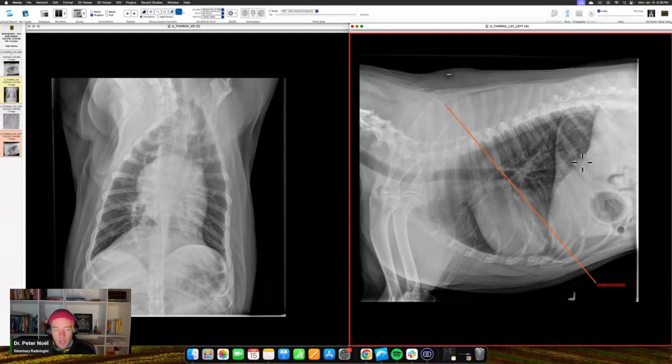Caudal dorsal, it's cardiogenic or non-cardiogenic pulmonary edema, and just plain probability, you're most likely dealing with the cardiogenic. Okay, so this is a cranial and ventral distributed alveolar pattern. The way you would describe this, I like to start with the anatomy, because if you read the report, the anatomy takes you right away. You say in the right middle lung lobe, there's increased soft tissue opacity that completely obscures pulmonary blood vessels and yields discrete air bronchograms. Done. The dog is obese. And then you conclude right middle lung pneumonia.